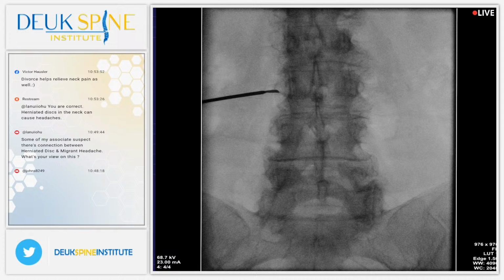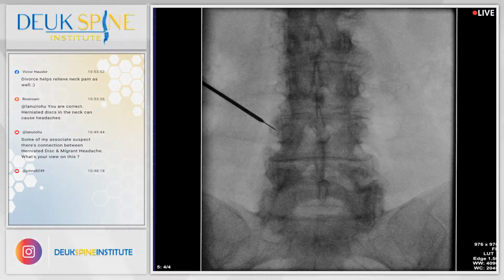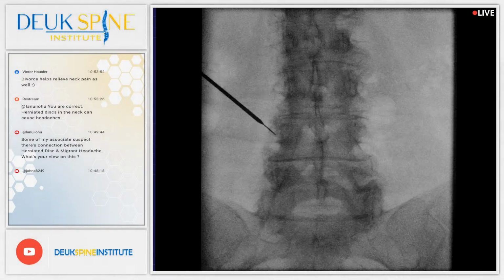All right. 2 down, 2 more to go on this side. Shot. Any questions from our audience? No questions. Well, we can't see the nerves in surgery. We're not exposing the entire spine. What we do is we can see the bones in the spine using an x-ray machine.